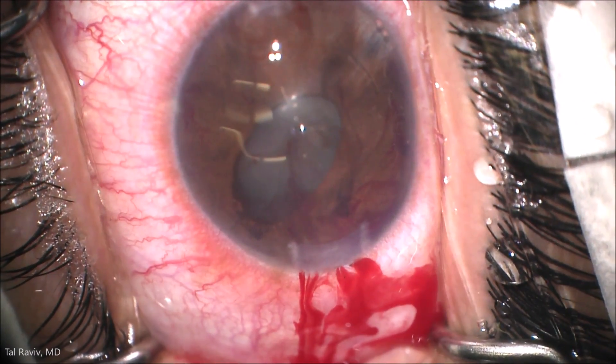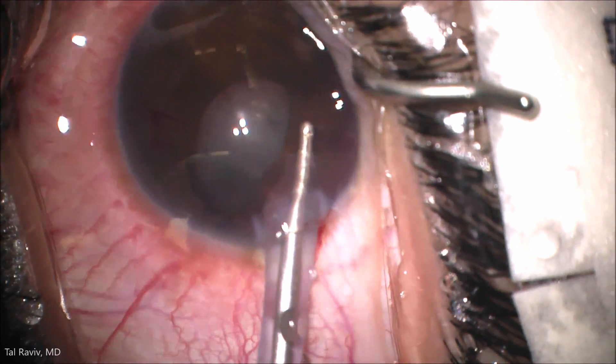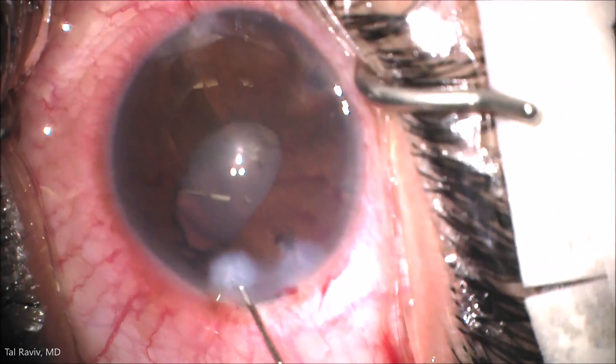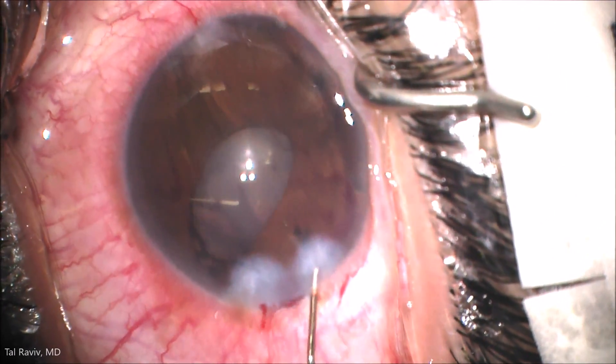The next step is to remove the viscoelastic carefully. This is a phakic eye — it has a natural lens — and then the wounds are hydrated with BSS.